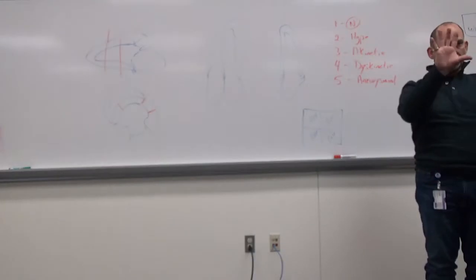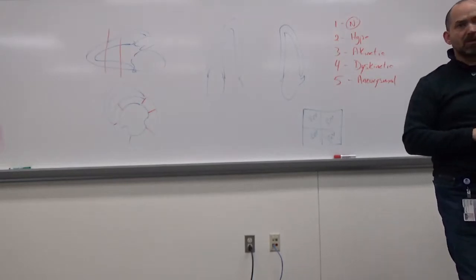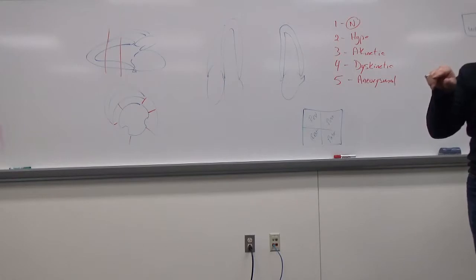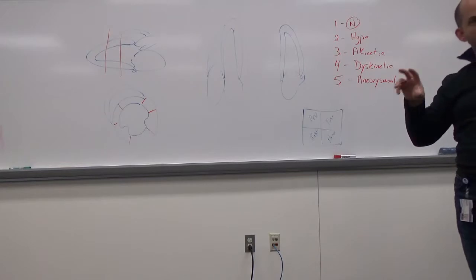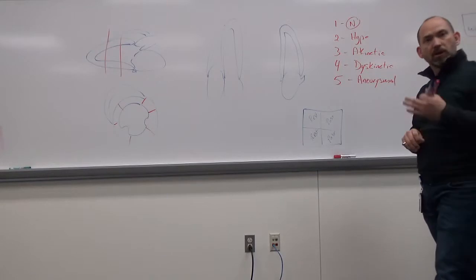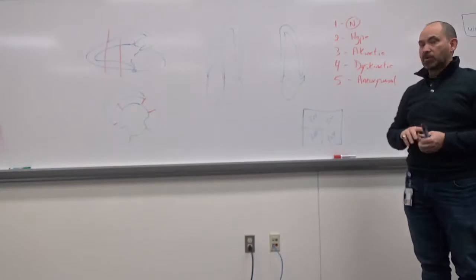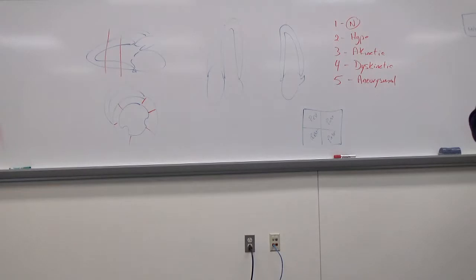So always be looking, if you've got 2 parasternal long axis views, you're seeing a progression of what's happening throughout the cycle. In dobutamine or pharmacological, we do a set of 4. So we're going to do a rest. We do a first dose, a peak dose, and then a recovery dose, or recovery after the doses are complete, watching the patient come back down to normal. Or they could do up to 7 of those. So just look at your progression of images. We're just looking to see how it changes from one part of the exam to the next part.